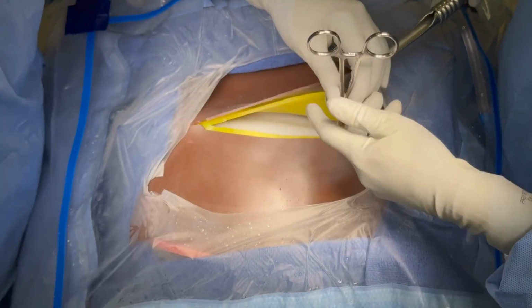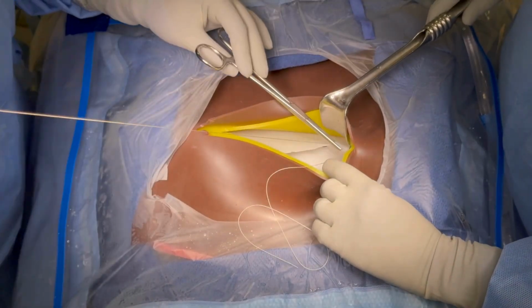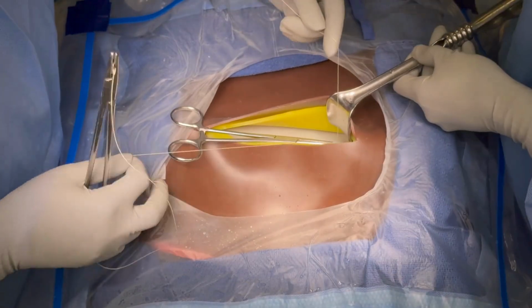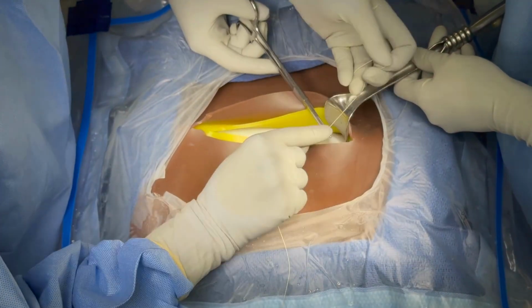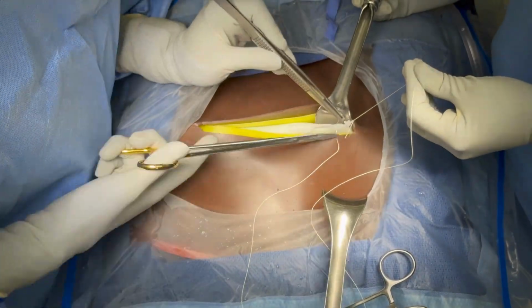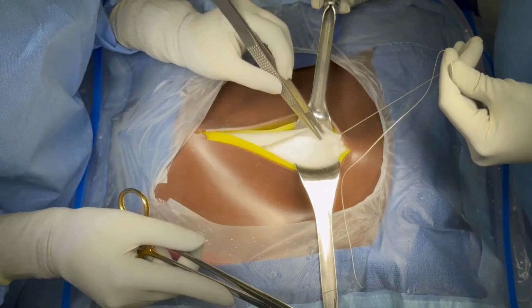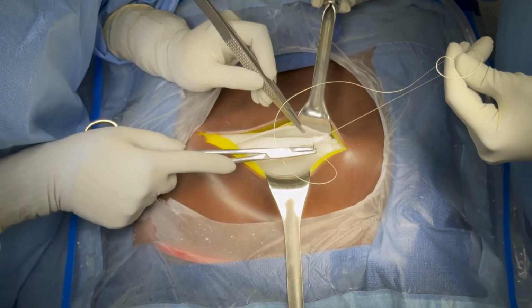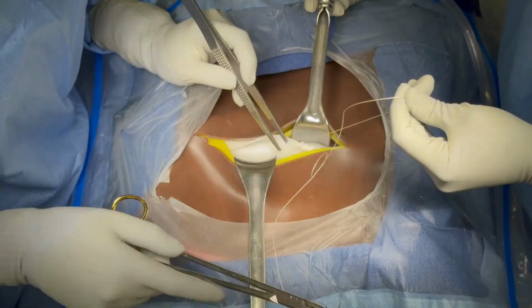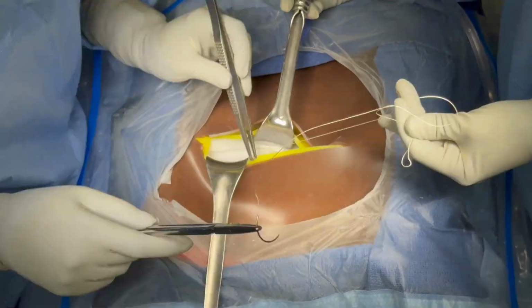A small Richardson, Army-Navy, or Goulet retractor can then be used to expose the lateral fascial edge, a Coker clamp is used to grasp the fascial edge, and a 0 Vicryl on a CT1 needle is used to reapproximate the fascia in a continuous, non-locked fashion. In patients at greater risk for wound dehiscence, a monofilament suture such as zero-loop PDS may be used in lieu of Vicryl suture to close the fascia.